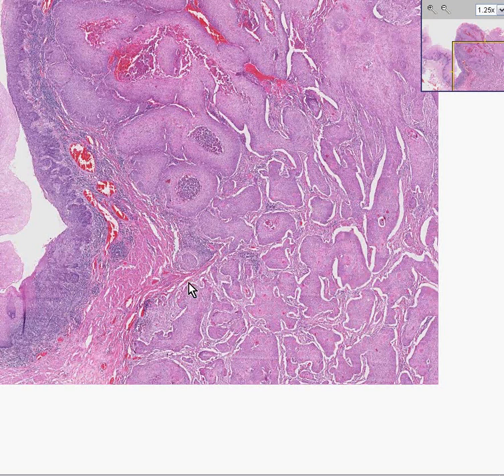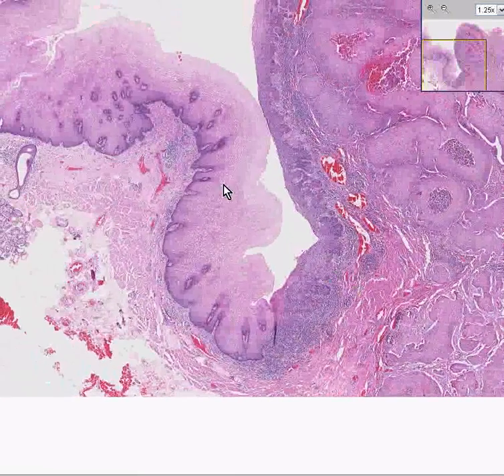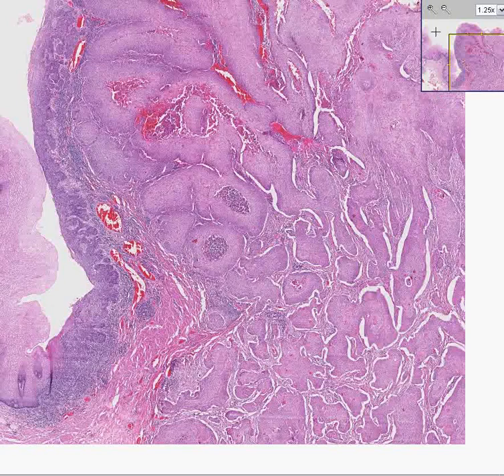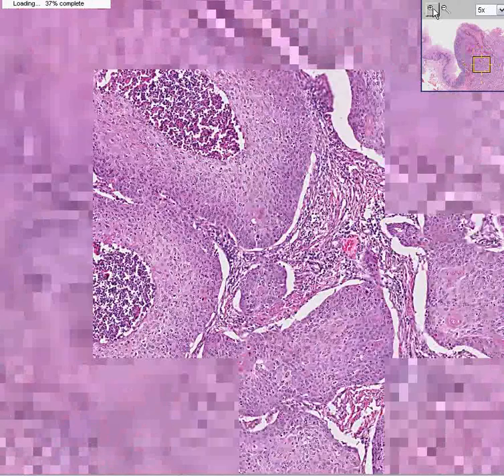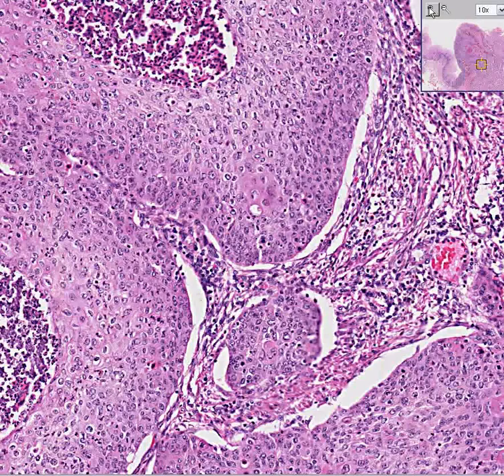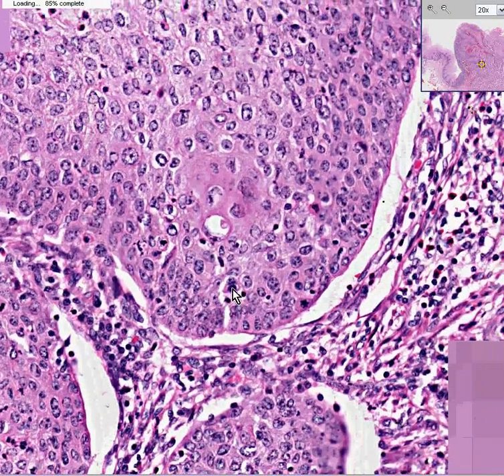When you get into the infiltrating portion, however, the inflammation doesn't look as severe as it is in the in situ area. And here is your absolutely normal mucosa. Isn't that beautiful? Let me point out another feature here which you may or may not have noticed already. When you get into the infiltrating areas, you could tell absolutely this is cancer. There are irregular cells.